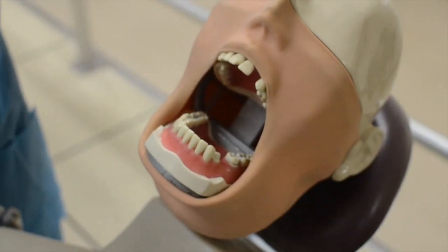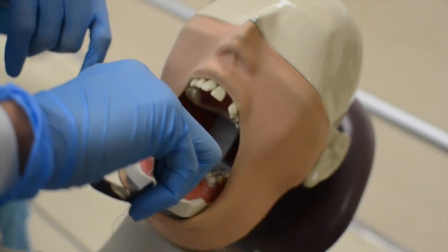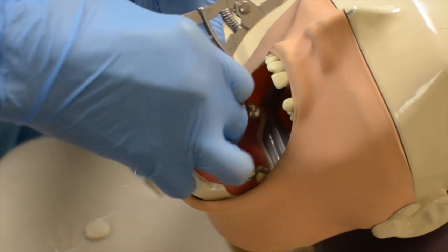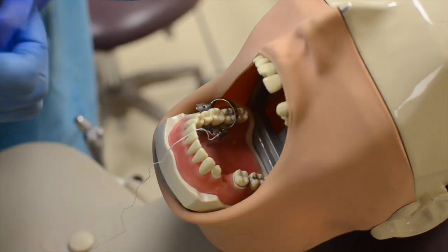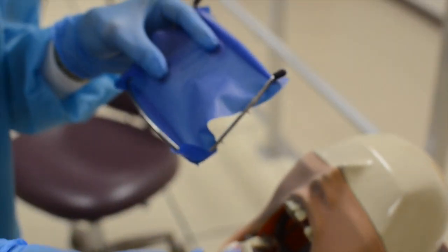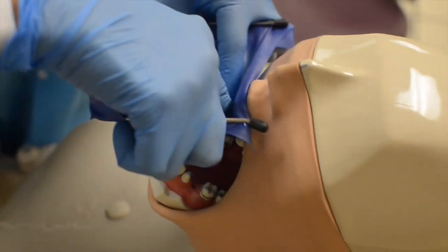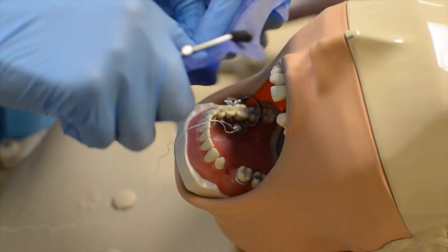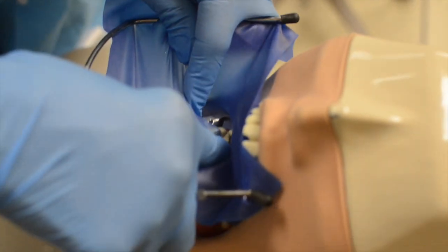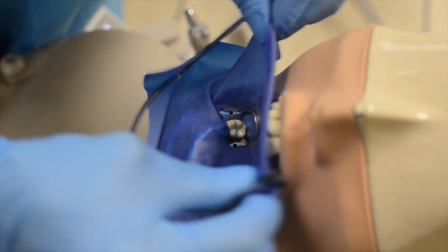The technique that I particularly enjoy using: I actually put the retainer on first. Shake it and make sure it's not going to move around. I've already attached the frame. I don't usually do that, but just to show you the different ways to do this. I've only made one hole here. I'll explain that in a little while. Now I'm going to stretch this rubber dam over. There we go. And I'm ready to work.